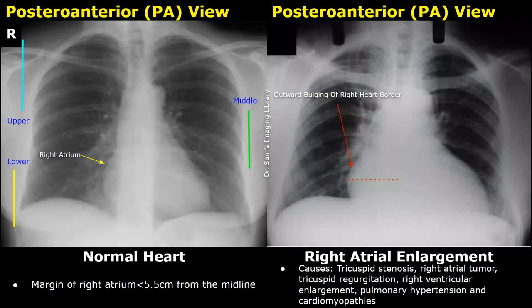The margin of the right atrium will be more than 5.5 centimeters from the midline in cases of significant right atrial enlargement. Causes include tricuspid stenosis, right atrial tumor, tricuspid regurgitation, right ventricular enlargement, pulmonary hypertension, and cardiomyopathies.